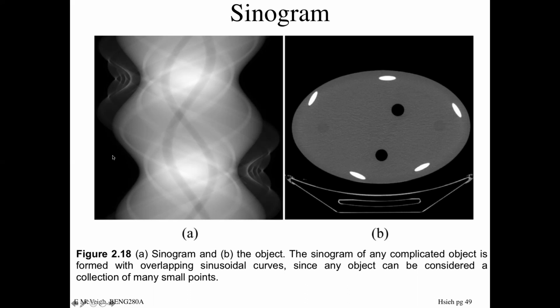This is what is called a sinogram. And a sinogram is all of those g(L, theta) stacked one on top of the other as a function of theta. Okay. So this direction is L. Do I have the coordinates here? Okay. This direction is L. This direction is theta. So I take, say, 400 different theta values, and for each one, I look at my sample, right, and I plot that and then stack them all one on top of the other.